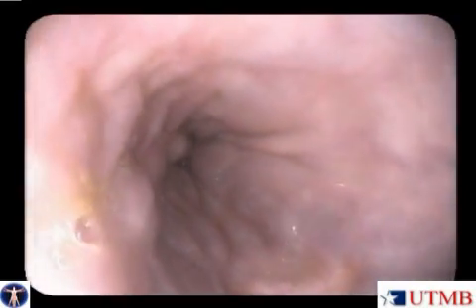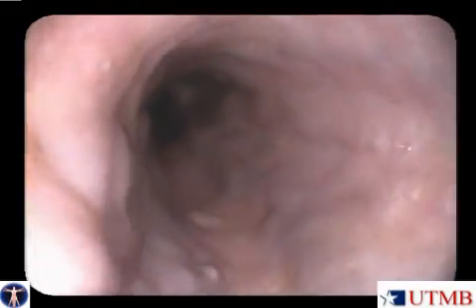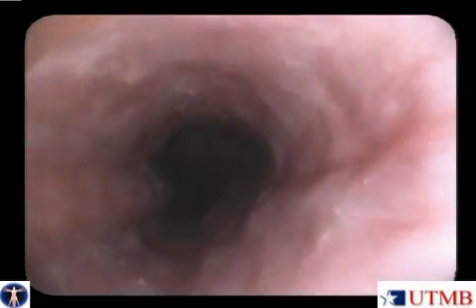Several months prior to this procedure, an MRA of the upper extremities revealed the likely cause of these downhill varices. This patient had developed compromise of her superior vena cava, secondary to a thrombus around her indwelling hemodialysis catheter, and the obstruction caused by this thrombus is what likely resulted in these downhill varices.